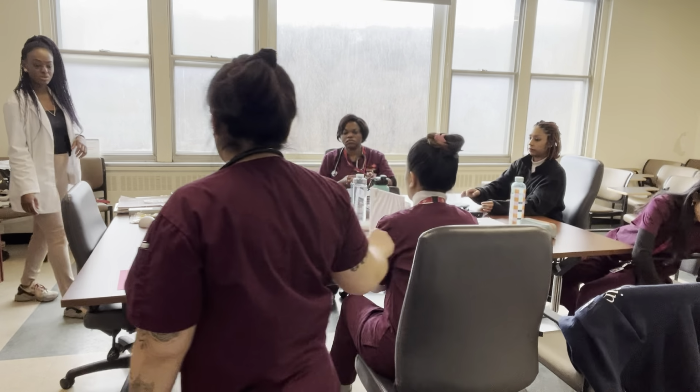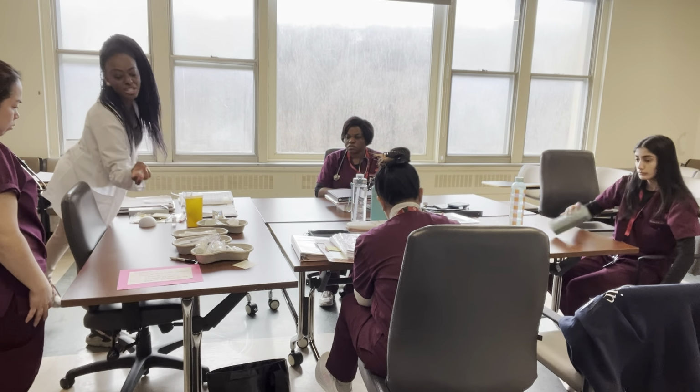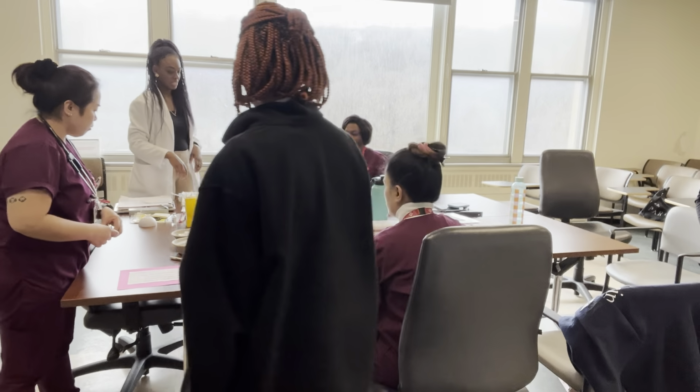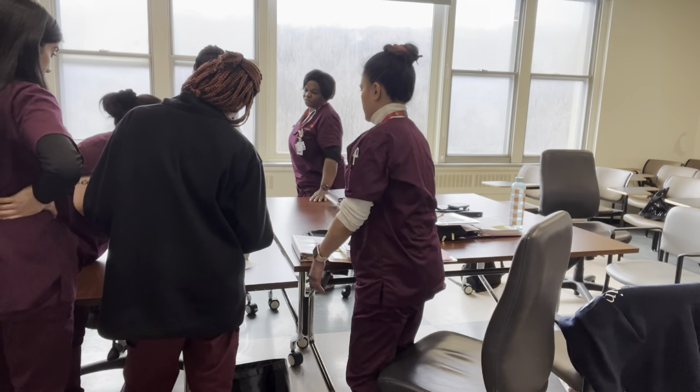That's okay if you're writing notes. So get your supplies. The spongy thing here is basically, we'll say it's the patient's abdomen or the back of their arm, something you inject into. Okay?